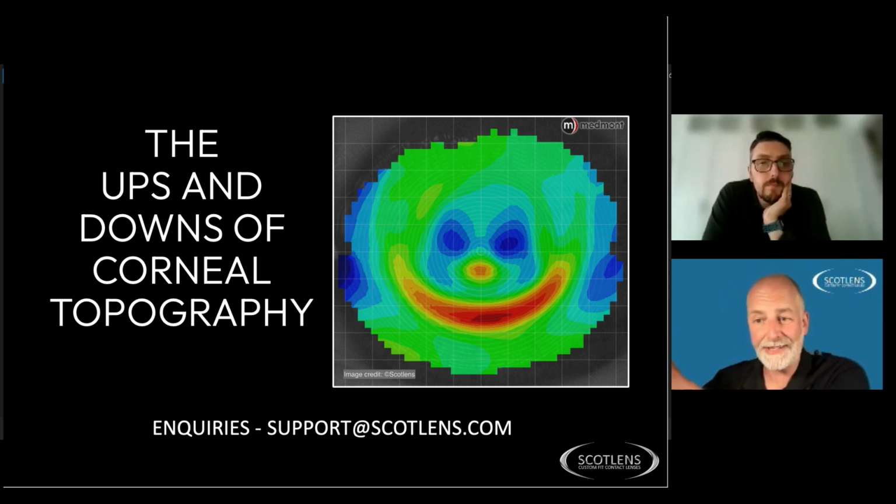Because another interesting thing, of course, with keratoconics, you've got this front surface cone that you can imagine from the patterns that I put up, but you also have the same thing happening on the back surface of the cornea. So quite often with keratoconics, when you put a GP lens on their eye, you trap that tear lens. That tear lens will naturally neutralize 90% of the front surface corneal irregularity, but then you get keratoconic patients that still don't get a good acuity. And it's because the back surface topography is so distorted that despite neutralizing the front, there's still a lot coming from the back surface of the cornea. So the Pentacam shows you that back surface as well.